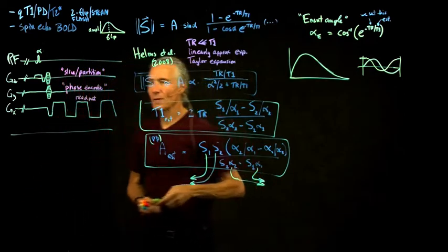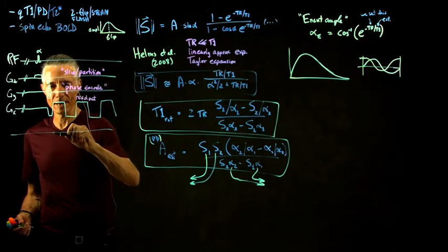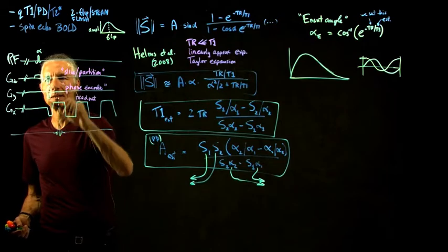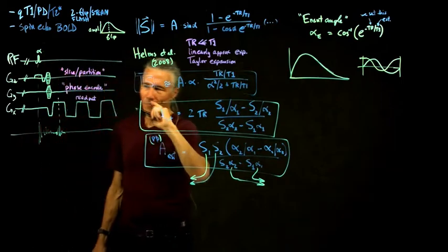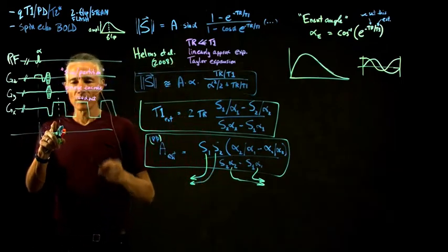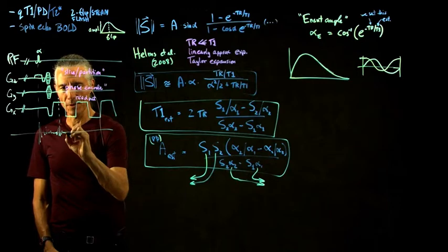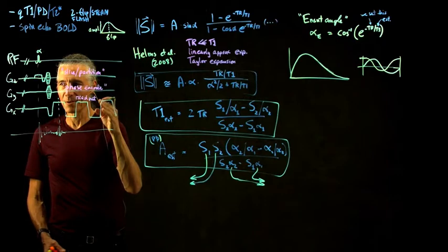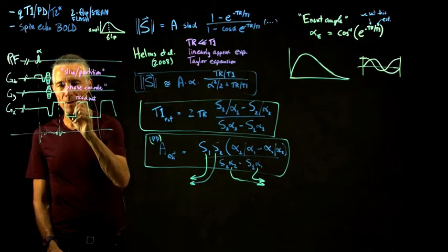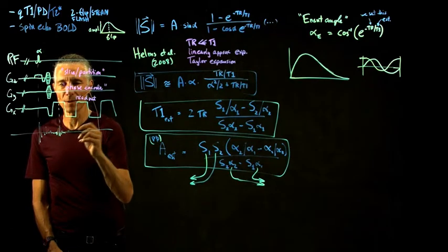What you do in EPI is, here's the first gradient echo. You would normally get a gradient echo like that. Here's the actual FID at the beginning. So that's a typical gradient echo. But if you turn the gradient on full blast the opposite way, at this point you will have wrapped up the spins to plus 128. Now if you go all the way the other way, you'll be back to negative 128.